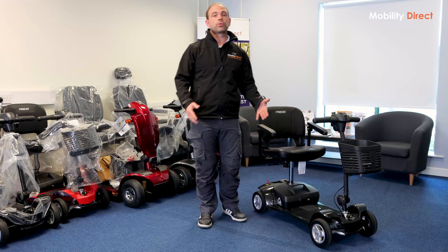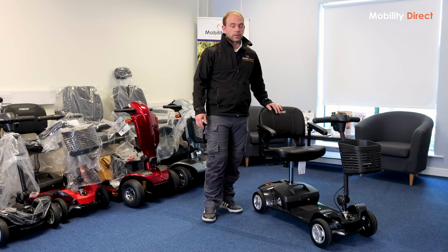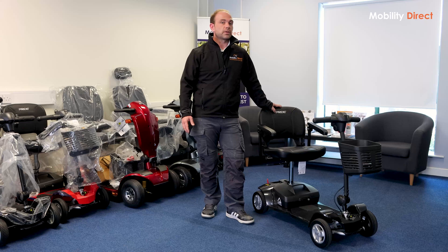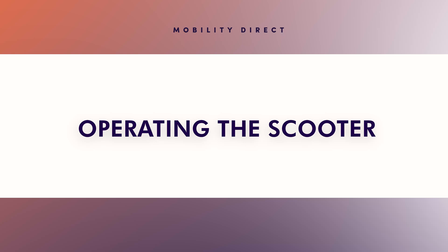If you're going to be transporting the scooter on a regular basis, you're going to notice it — it's going to make things a lot easier. They've also redesigned the seat. It's the same style of seat in a lot of ways, but they've brought the weight down. It weighs 10.4 kilograms on the Apex Light, and this one weighs 8.5 kilograms. So it's a weight saving of about 20%, which is going to make things a lot easier, especially when transporting the scooter.